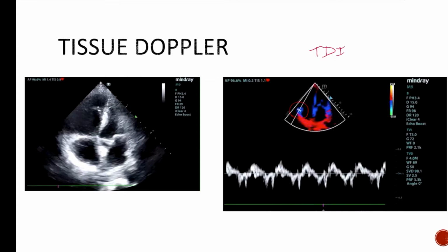We start to see, very similar to when we looked at diastology, that there are a couple different waves. We have what looks like an E-prime wave here, which we spoke about before. We look at what looks like an A-prime wave here. But we didn't talk about this wave too much in our last session when we talked about diastology. And this is something called your S-prime wave. And this is the velocity of the movement of the tissue upwards towards the probe. Remember, when we're moving upwards towards this probe, we're going to see an upward velocity on our plane at the bottom of the screen. So this is another surrogate that we can use to look at RV systolic function.